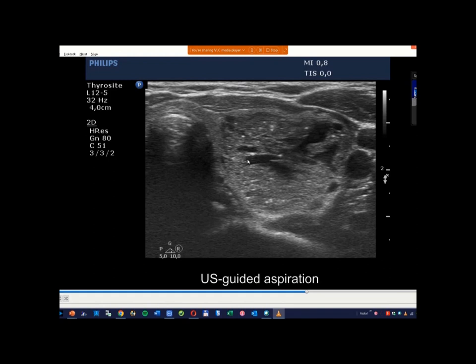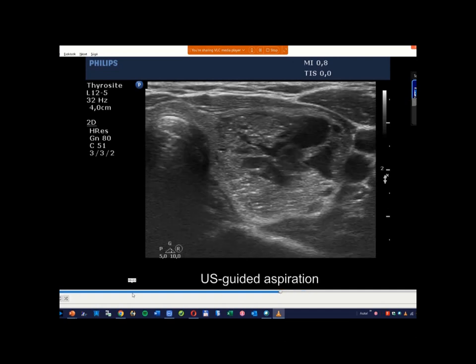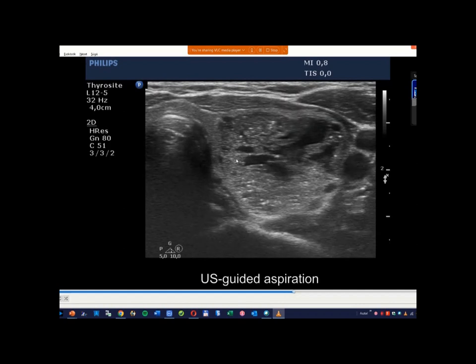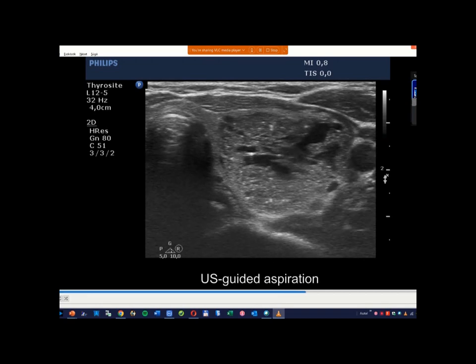Yeah, the cystic part is very large. But here, it is a very typical form of reverberating artifact. These tiny lines, dorsal to this figure, are proofs of comet tail artifact. Here, focus on that granule. So the Korean society is the only society which states that the presence of a single comet tail artifact excludes malignancy.